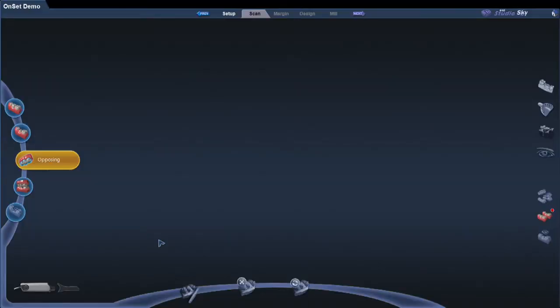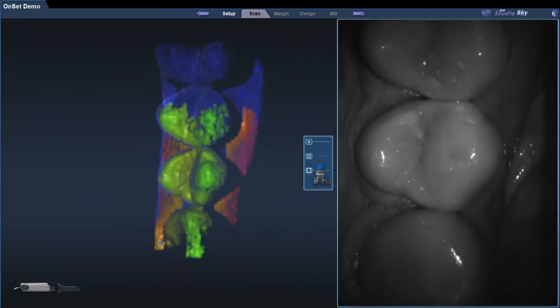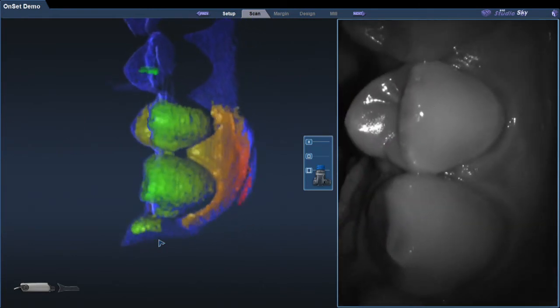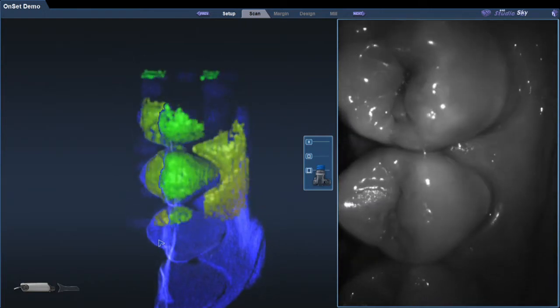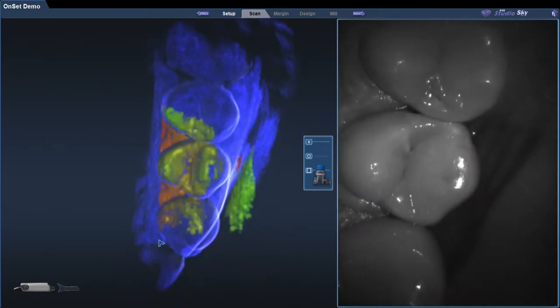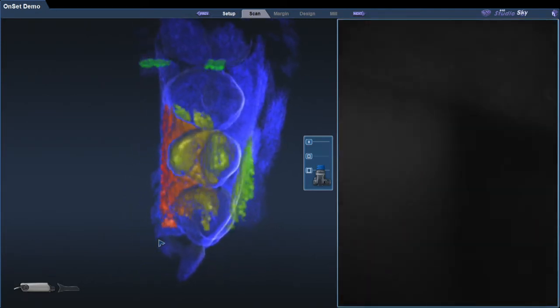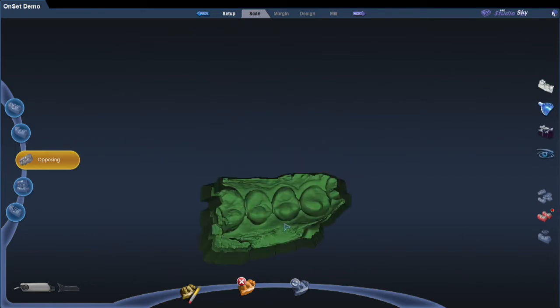I'm going to scan the opposing while we're waiting on the anesthetic. We'll switch over to our scanner and scan from the second premolar to the canine. I don't have a timer running in my office at the moment, but you can get an idea as to how efficient this is. We really have everything we need right there — that's all the scanning we need to do. In this case, since it's such a simple case, I'm going to just scan the prep scan whenever I'm done with the preps.